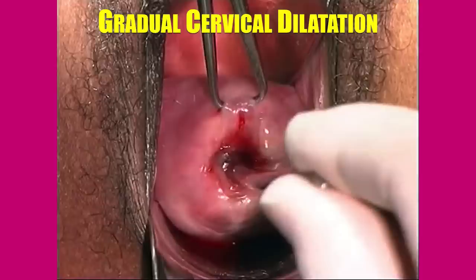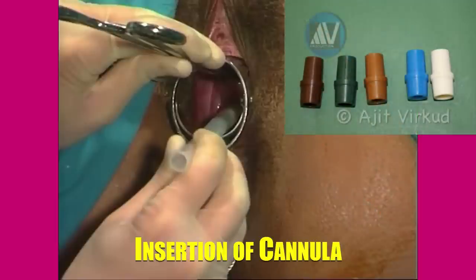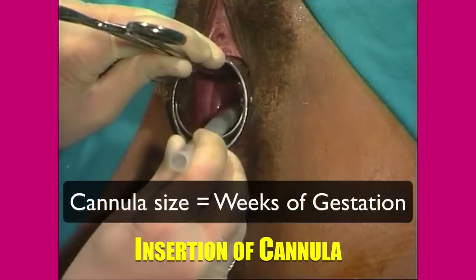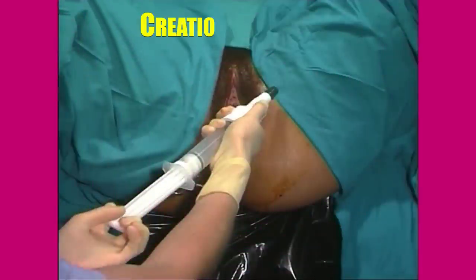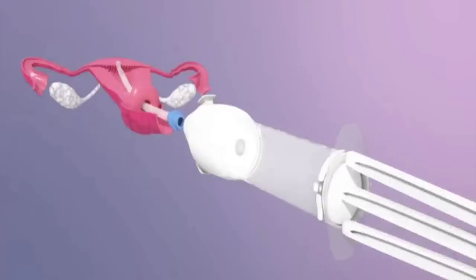Remember that the tip of the dilator should go just beyond the internal os and not right up to the fundus, to minimize the chances of fundal perforation. The appropriate plastic cannula is then inserted almost up to the fundus. For small size cannulas, an adapter that fits the syringe may have to be used. The formula for cannula size is the same as the period of gestation — for example, 10 mm for a 10-week pregnancy. Before connecting the MVA syringe to the cannula, it is charged: vacuum is created by closing the pinch valves and applying firm traction on the piston till it locks into position. See the animation for the same.